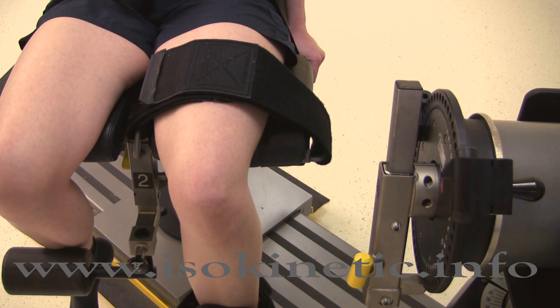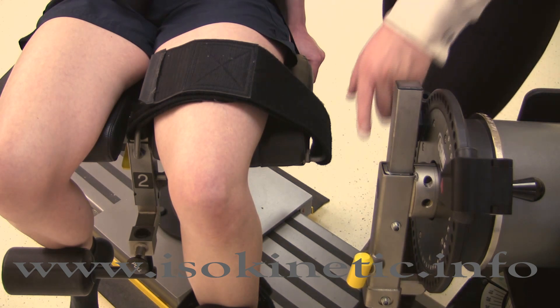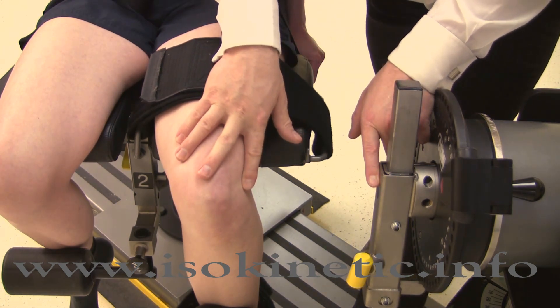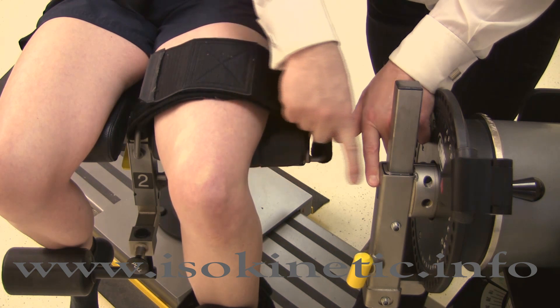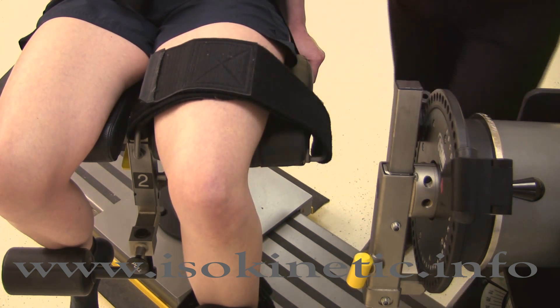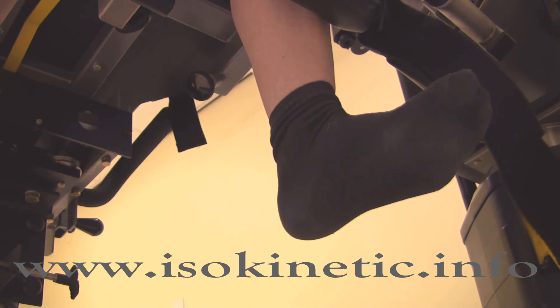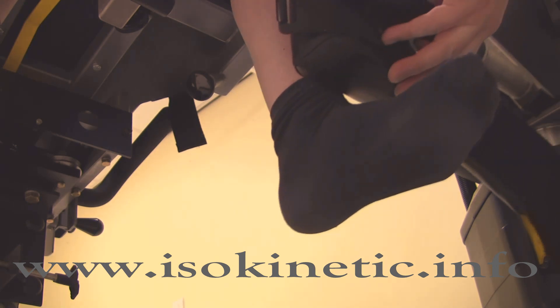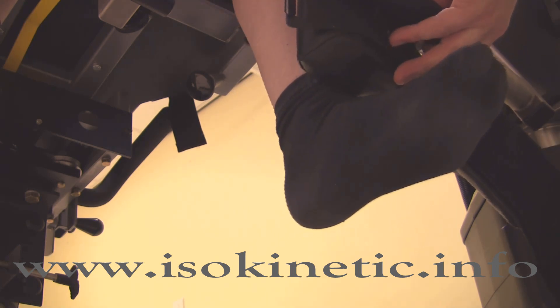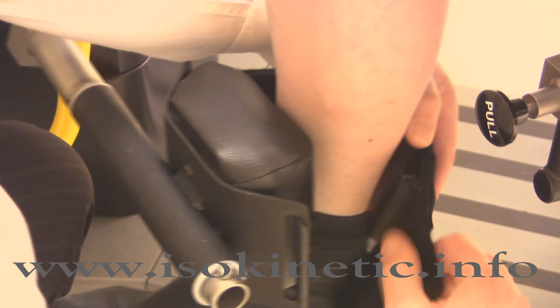Now the axis of rotation needs to be set. The axis for the joint needs to be directly opposite the black dot on the input arm. The axis of rotation for the knee is the lateral femoral condyle, or the lateral joint line. The chair fore/aft and the dynamometer height may need adjustment to achieve the alignment. To position the calf pad on the shin, start by maximally dorsiflexing the foot, then adjust the pad until it hits the top of the foot. Secure using the strap.